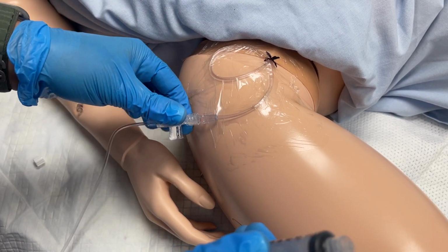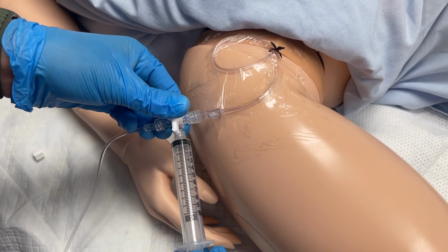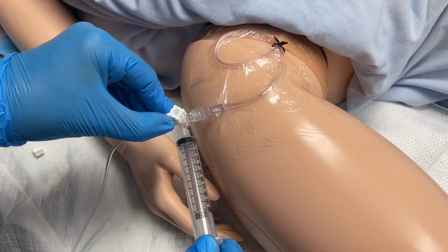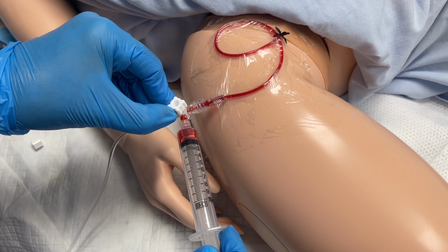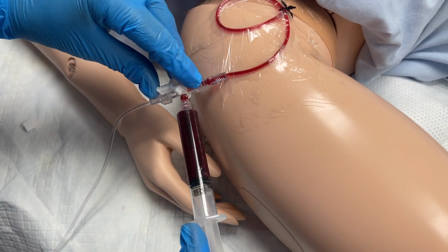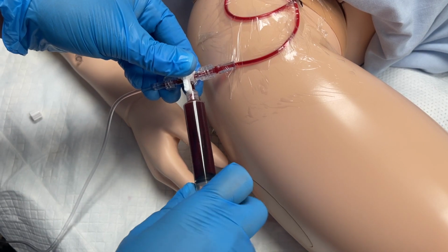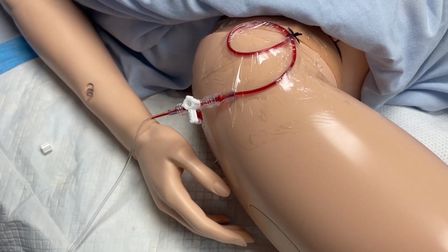Attach an empty, sterile 10 cc syringe and then turn the stopcock towards the line, meaning away from the patient. You will then pull back the required amount of waste. In this case, I'm removing 10 milliliters. That ensures that none of the inline saline is in our blood specimen. In between each of these steps, it is imperative to return the stopcock back to the off-to-air position. This will prevent any arterial blood from pulsating out that open port.